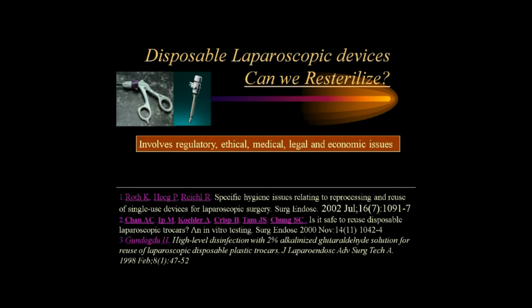Yes, of course, if we re-sterilize the disposable equipment, it makes economic sense. But if a patient gets into trouble, who is to blame? Is it the instrument designer or instrument maker, or who did the sterilization of the disposable equipment? The legal problem is there.